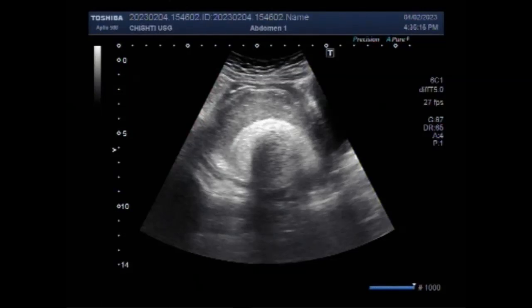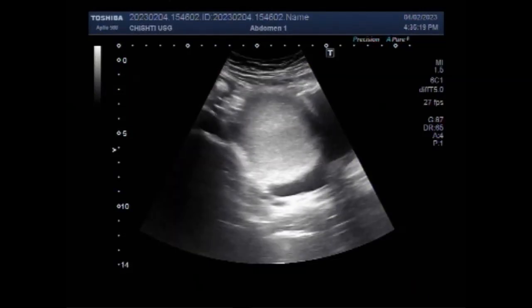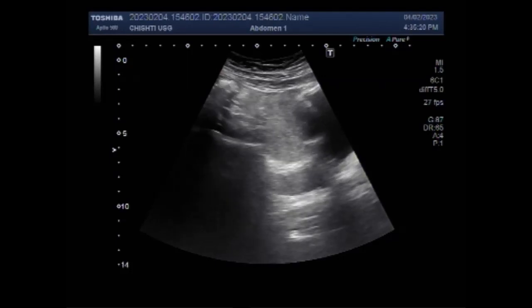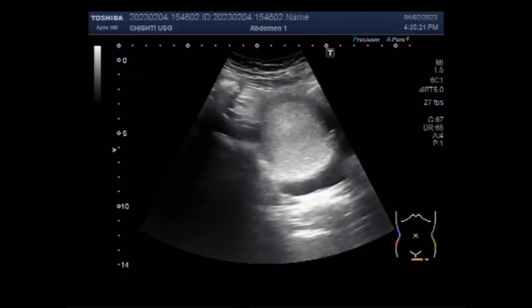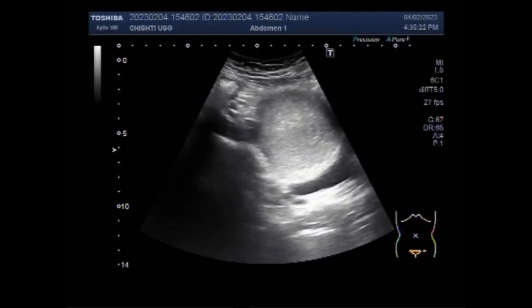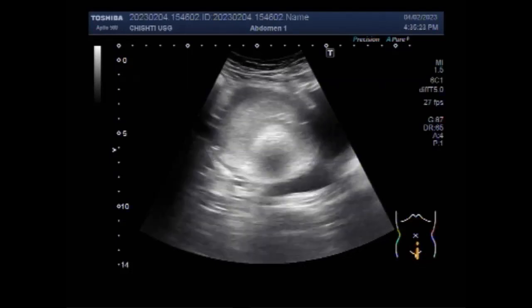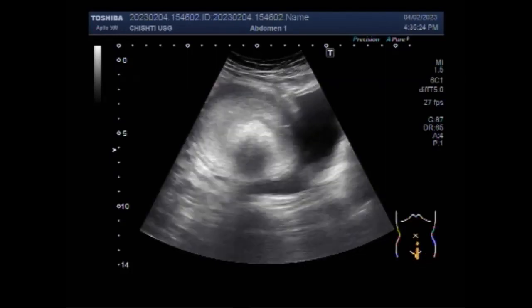Dear viewers, I hope you are all fine. This ultrasound video shows a large chocolate cyst having a solid mass in its interior.